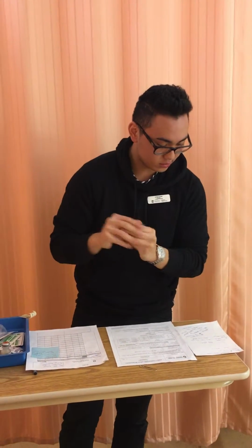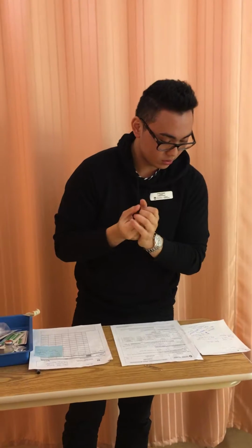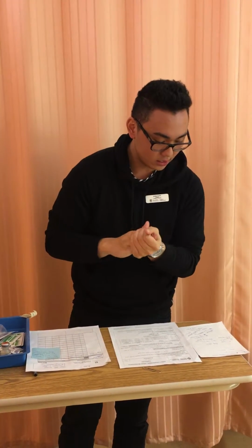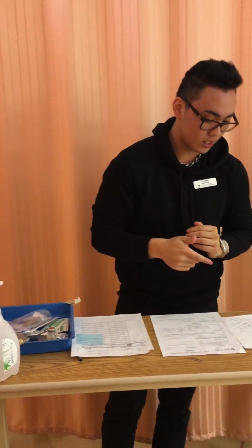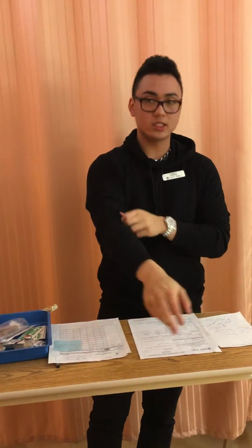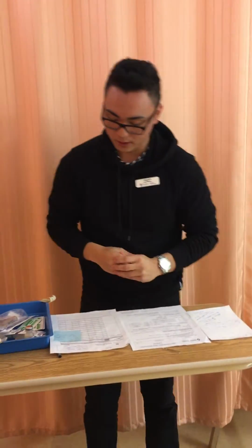The doctor's order states that she has a respiratory infection, and the patient is Penelope Pacheco. The doctor has ordered Cefazolin 750 milligrams through IV, which is due right now and will be given 3 times a day. It also states that she is currently running through normal saline, and according to the drug monograph, that normal saline is compatible with the drug we're giving right now.